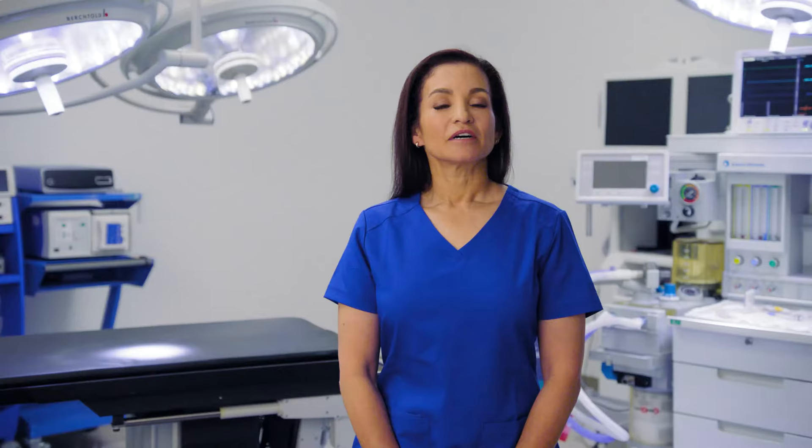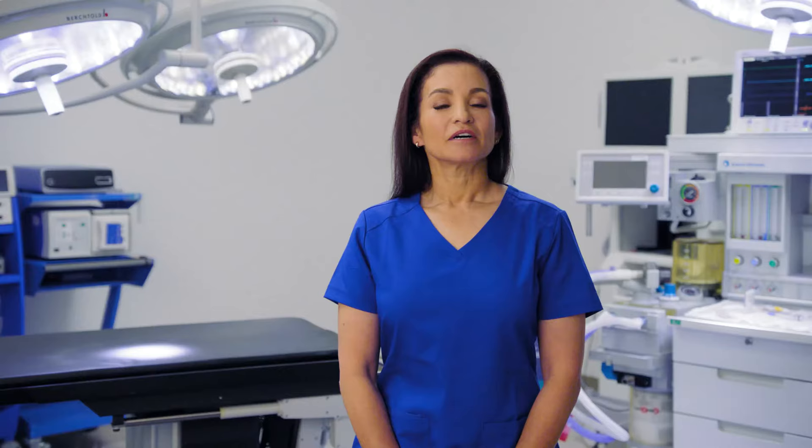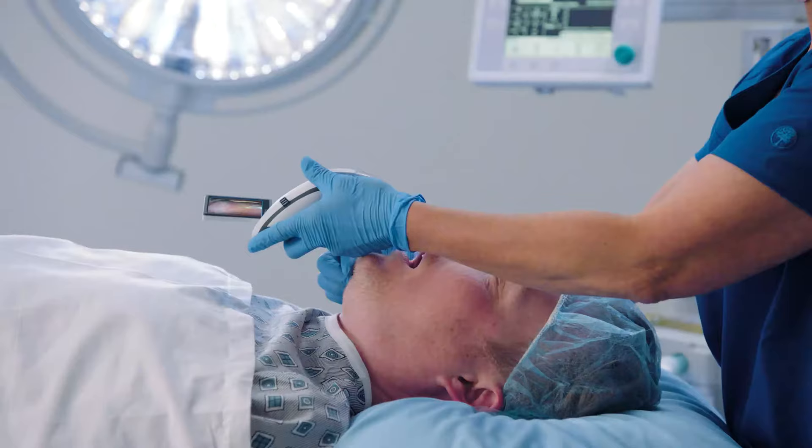Improved optics — four times more pixels in the camera, a brighter LED, and a wider field of view — enable a crisp, clear image of the anatomy.